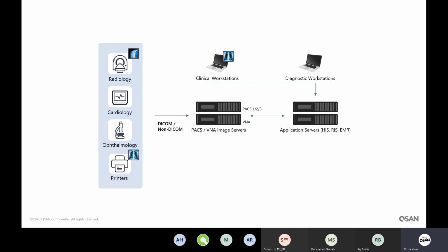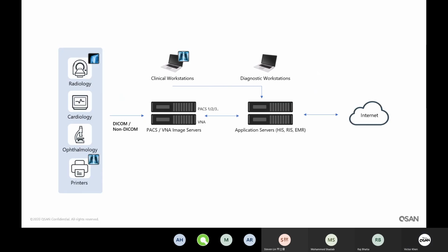And for sure, whenever you come, you process your images, you get your scans, it's associated with the database, and the doctor will be able to immediately show you pictures using the clinical workstations. Or, for example, if doctors would like to check it by themselves, you have diagnostic workstations as well. And now we have the internet, for sure, so a lot of doctors, especially during coronavirus, are working remotely.